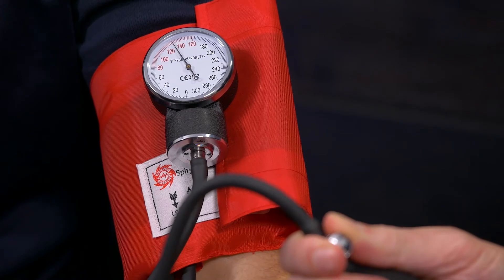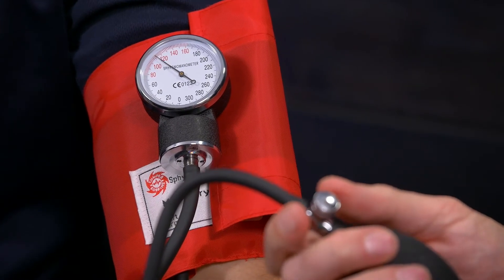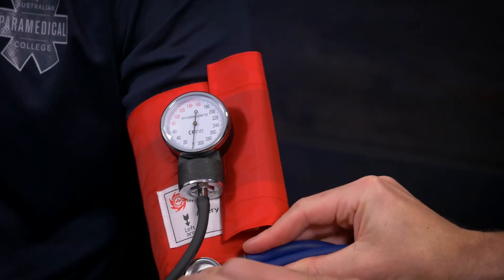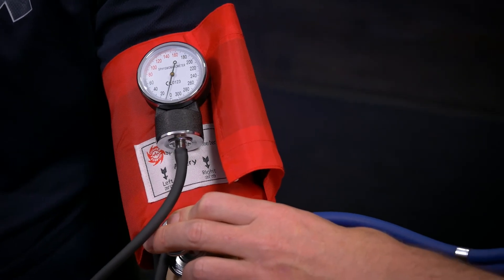And there it is — 110. So by palpation I have a systolic blood pressure of 110. So if I was to repeat that now by auscultation: take my ears, pop them in, pop that on the cuff, pumping up.